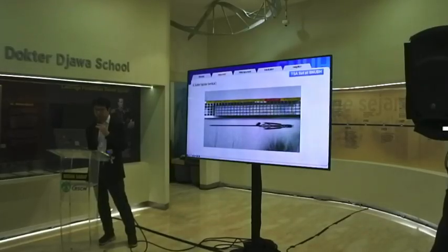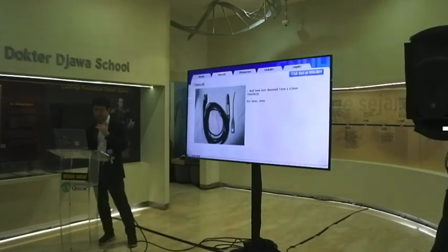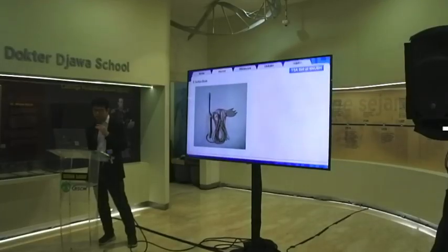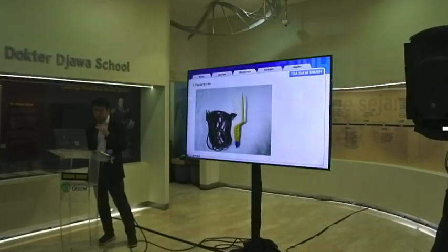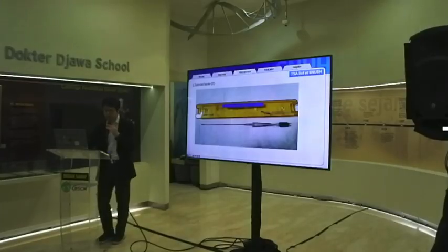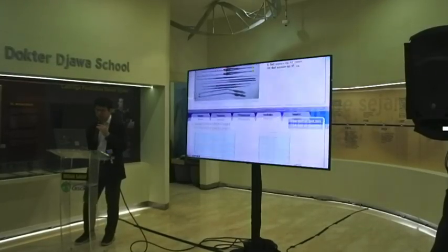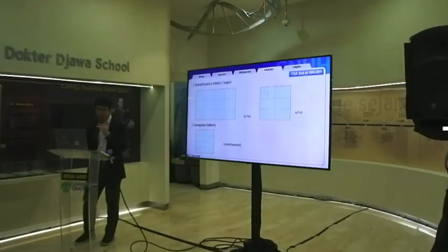We are using Sutter bipolar. And this is the Midas drill. The suction body, and T-type bipolar, and extended bipolar, and so on. I cannot mention all of these. And when I use the Tachocomb, we cut the Tachocomb in this fashion.